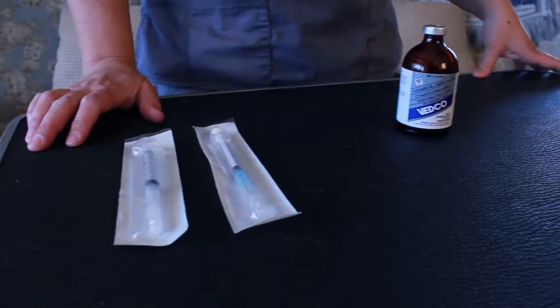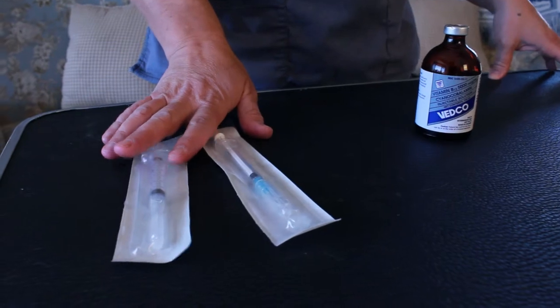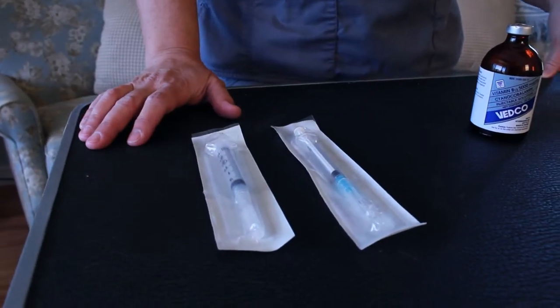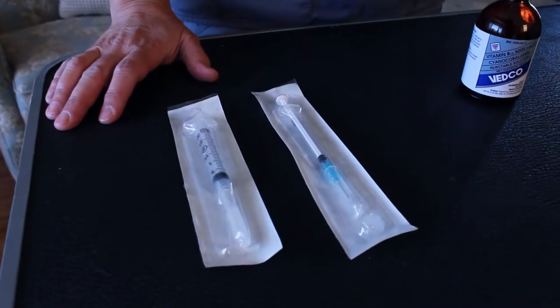So today I'm just going to go over how to draw up a shot and administer a shot so that you're not nervous when you do it on your own. The first thing is you want to make sure you have your syringe. Sometimes they'll give you a 1ml skinny syringe, sometimes they'll give you a 3ml fatter syringe. You may also have an insulin syringe.